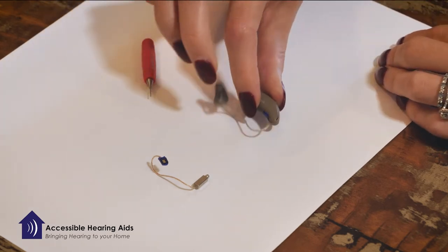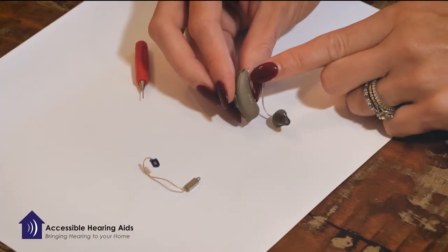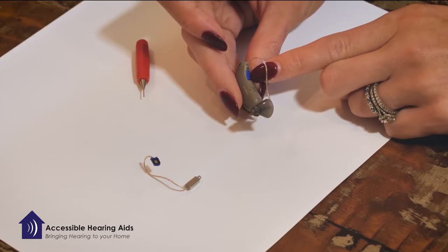What you're going to do is look for the very small pin opening right next to the color indicator on your hearing aid. This will either be red or blue.